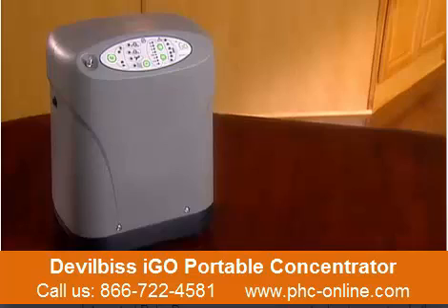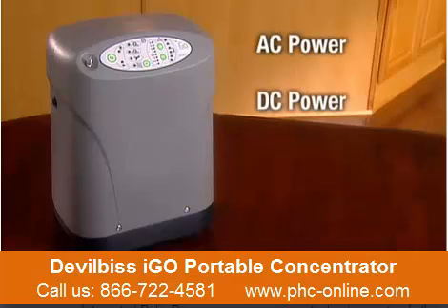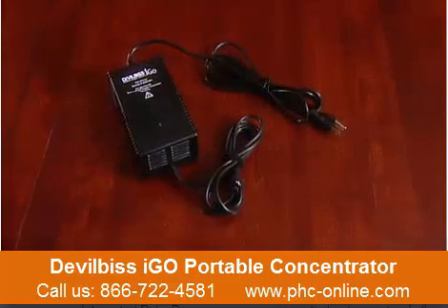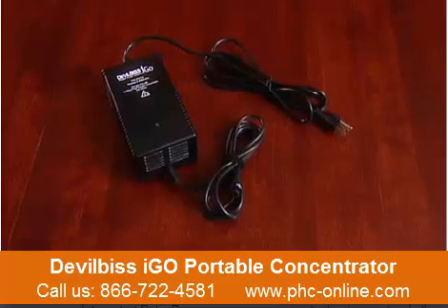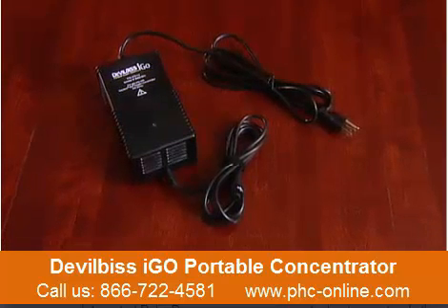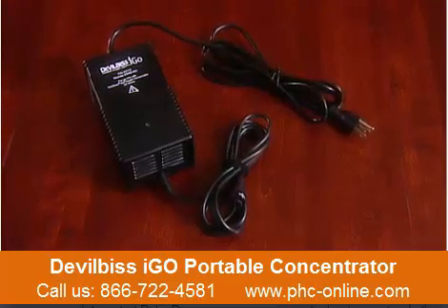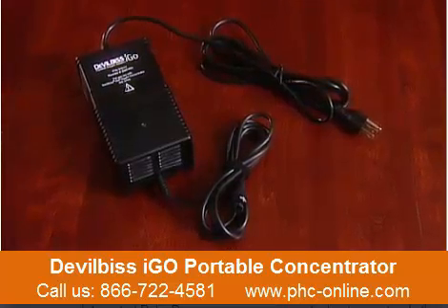Your iGo system can be operated from 3 different power sources: AC power, DC power, or rechargeable battery. The system includes a universal AC adapter and power cord that should be securely inserted in the power input on the side of the unit. Plug the other end into a grounded AC outlet.